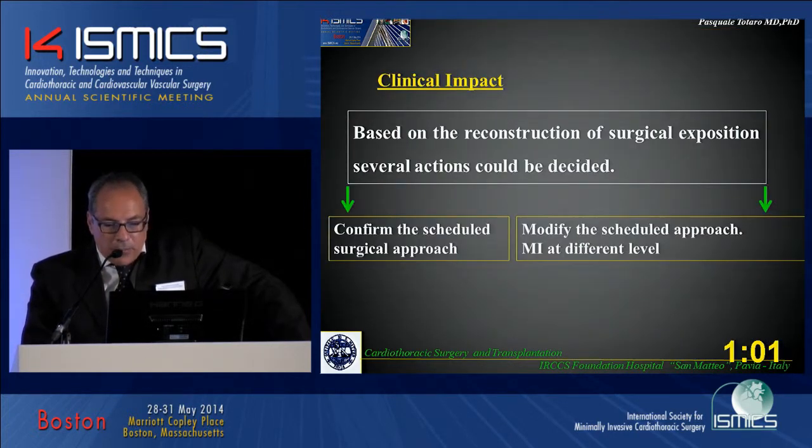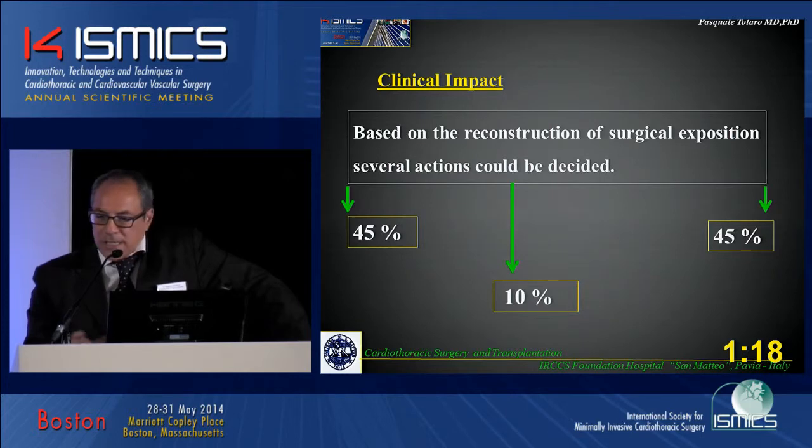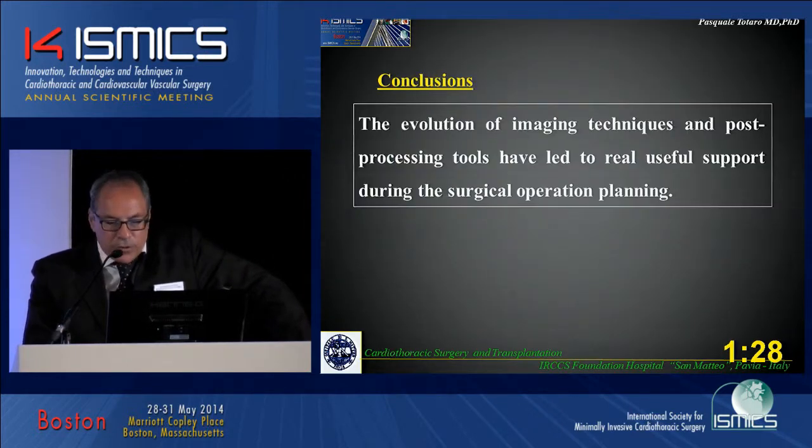We evaluated the clinical impact of this. Based on this reconstruction, you can decide to confirm the schedule of the surgical approach. You can modify the schedule of the approach, so changing the level, but you can also abandon the idea of a minimally invasive surgical approach. And that is the result we had in terms of application. As you can see, in 10% of cases at the end, we decided to abandon the idea of minimally invasive and we went for full sternotomy.